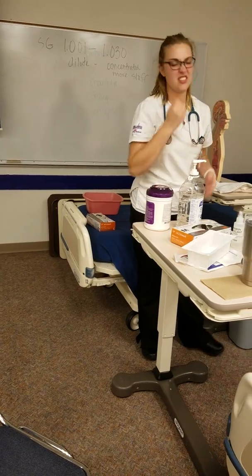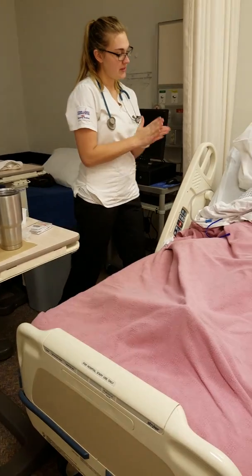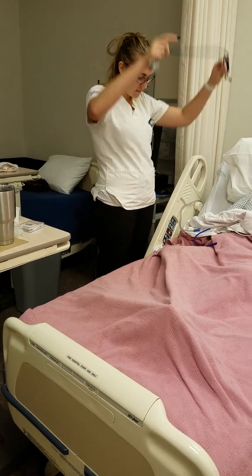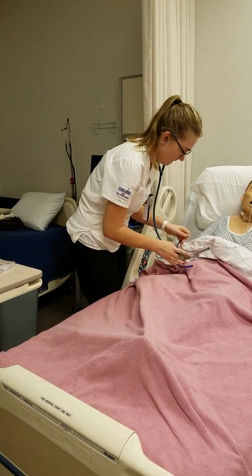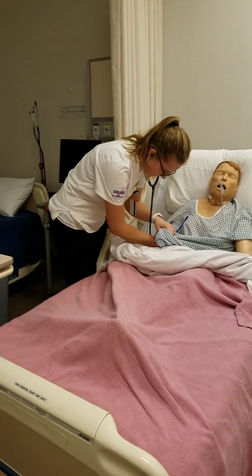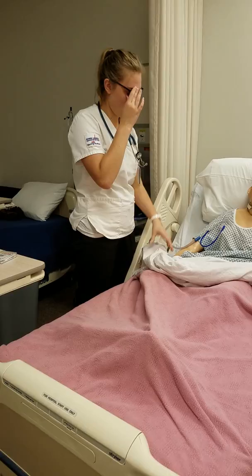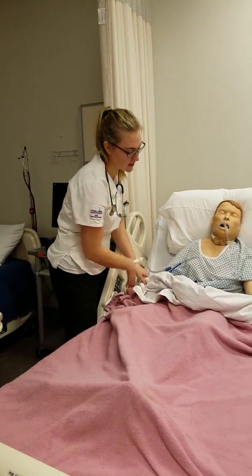And now that the physician ordered that the NG tube come out, I'm going to perform hand hygiene. Oh, Mr. Smith, how are you doing? That's good. Looks like there's good news. You're going to get your NG tube out today. So first I'm going to also try to hear those bowel sounds. And before I get too much further, can you verify your name and birthday for me? Okay, I'm going to double check the wristband, and I see that is correct.